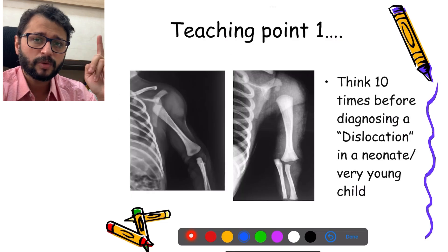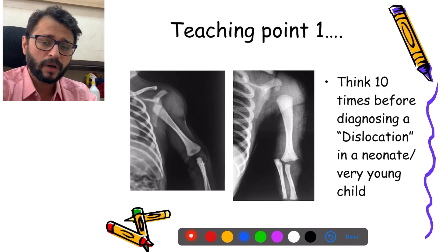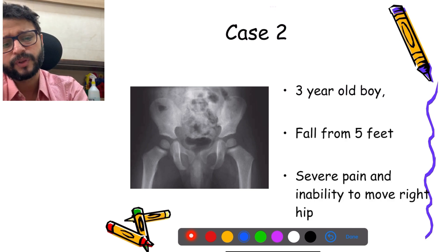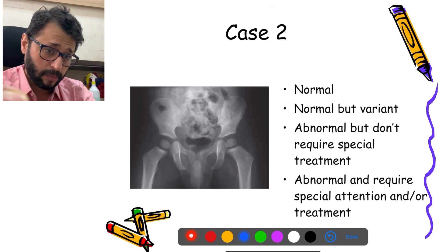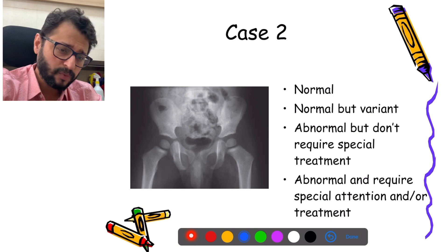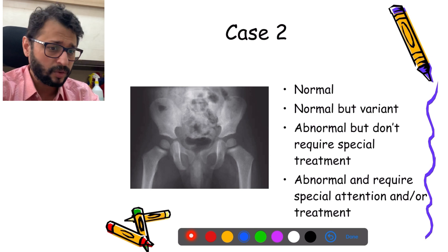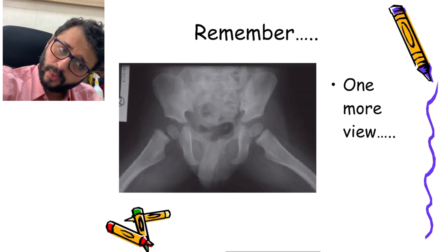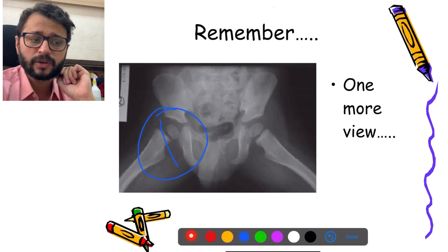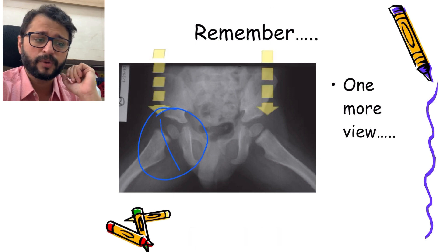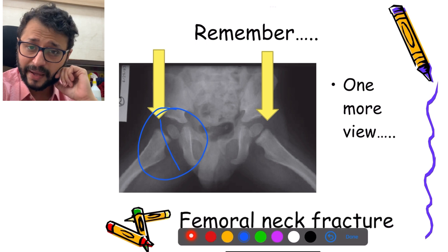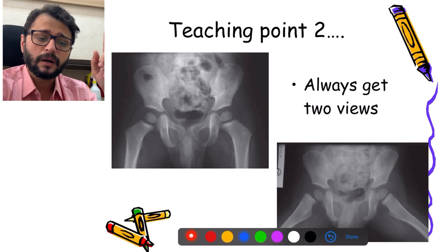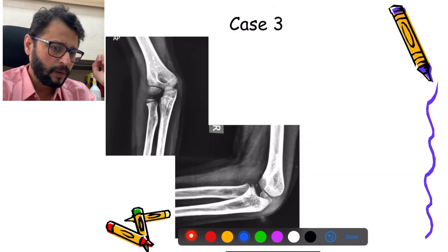Teaching point one: think ten times before diagnosing a dislocation in a neonate or a very young child. Next case: a three-year-old boy with a fall from five feet height, severe pain and inability to move the right hip. This was unfortunately labeled as normal. But you should always get one more view — the second view reveals a cleavage plane showing a Type 1 physial injury of the proximal femur, which is a femoral neck fracture requiring appropriate treatment. Teaching point two: always get a minimum of two views, especially in a traumatic situation.